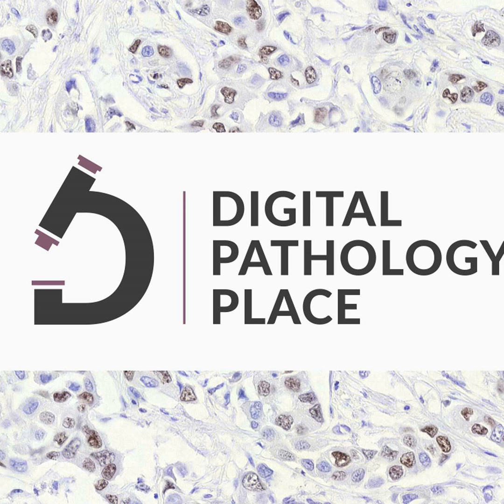So for H. pylori, they used Python and PyTorch. What were the big challenges they hit during this development phase? Was it the AI model itself? Interestingly, not primarily the model, though they did make specific choices, like labeling ambiguous regions as positive to boost sensitivity. The biggest time sink, according to the paper: integration. Getting it to talk to the hospital system.